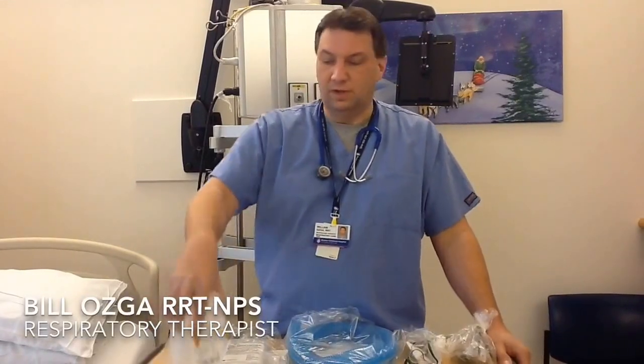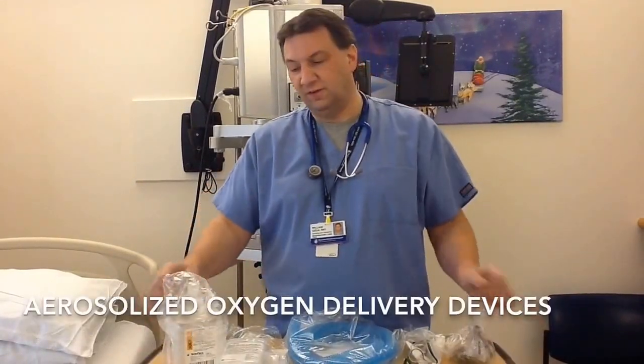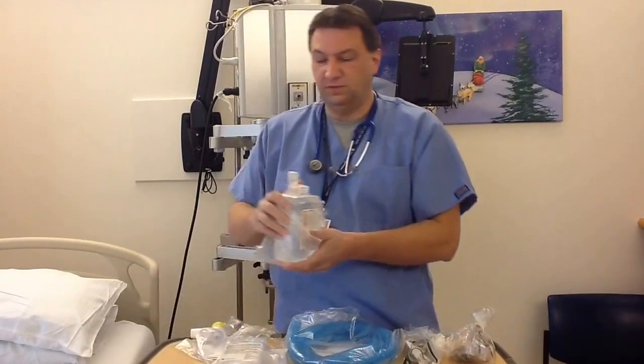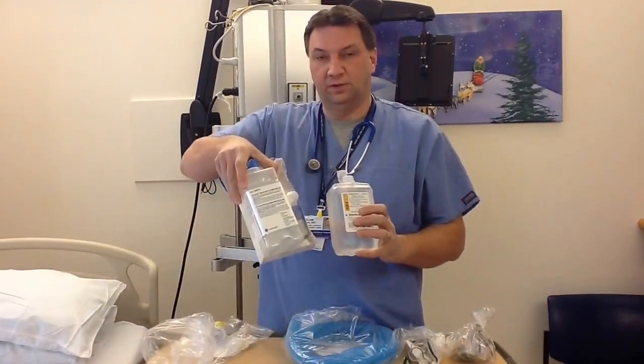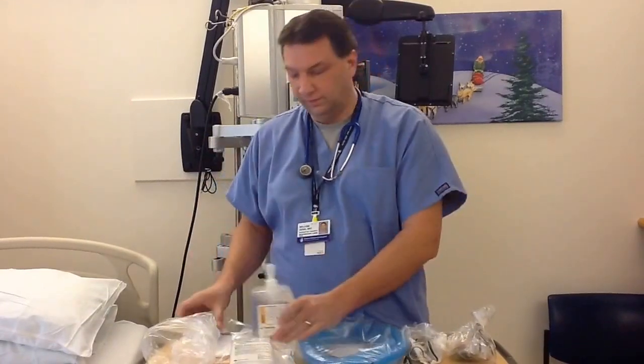Hi, I'm Bill from Respiratory. We're just going to go over some aerosolized delivery oxygen devices. We're going to start off with the setup of the device. We have 2 different manufacturers out there currently that we're going to use, and we'll go over both of these.